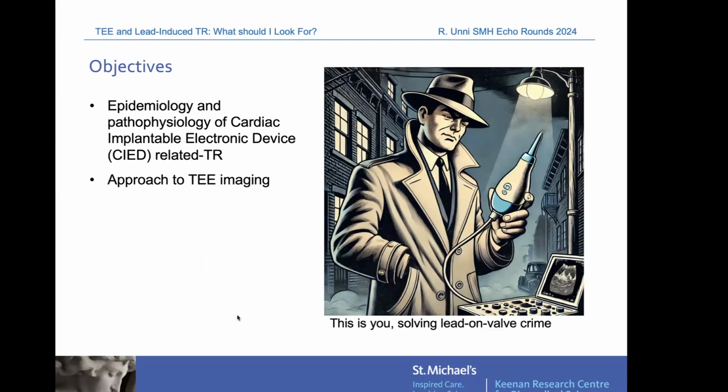The imaging talk is directed towards some of our community labs listening. But my hope is that if there are sonographers online and here, the principles are exactly the same, and you can apply them when you're scanning transthoracic echo, and the same with the cardiology residents. My hope is that after this talk, when you see someone in the ER with severe TR and you want to do a bedside echo, the principles you see in this talk can be applied.